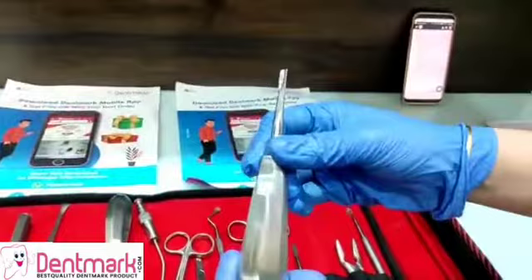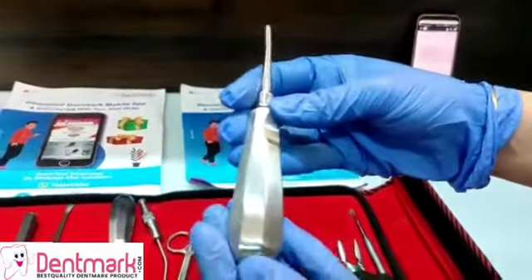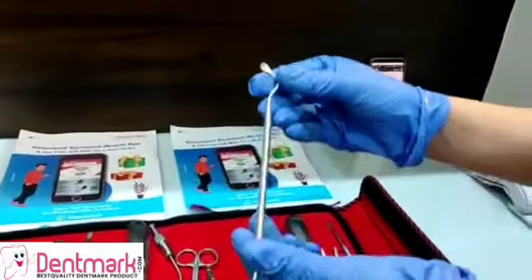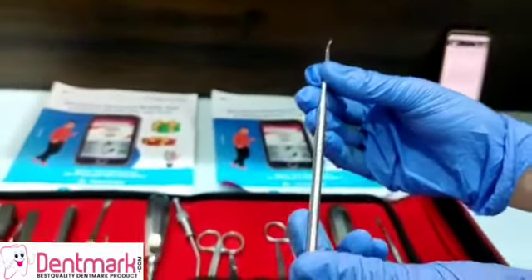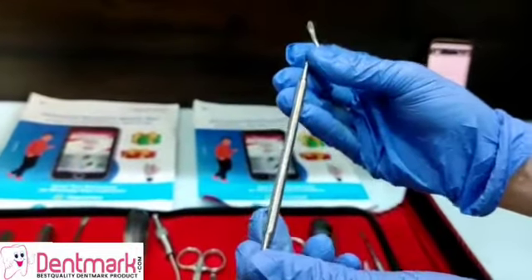As you can see, these have very large handles with serrated handles for better grip and comfortable working of the dentist. Apart from these, the working ends are very sharp for precise working of the dentist, and also these ends are thin and anatomically designed.